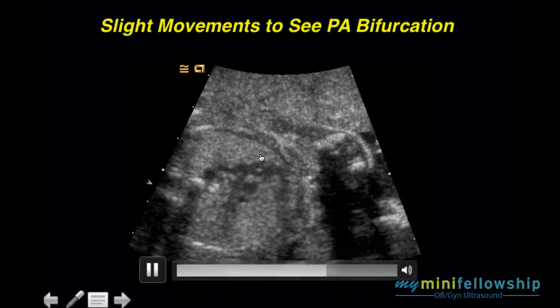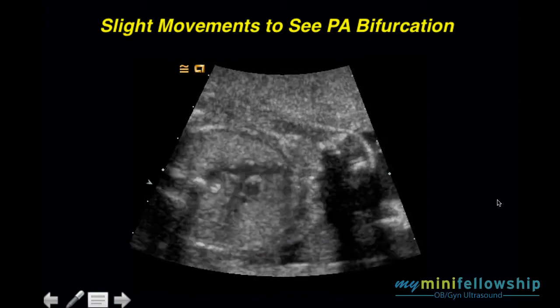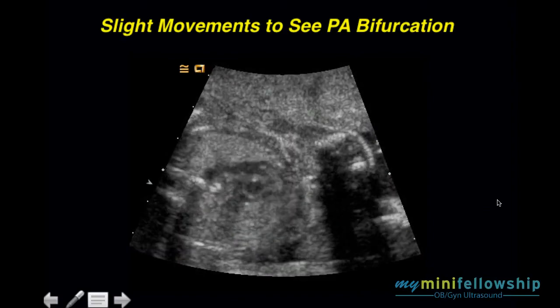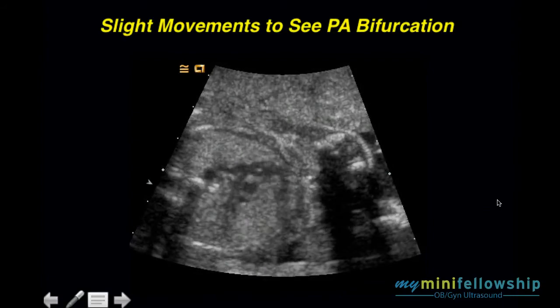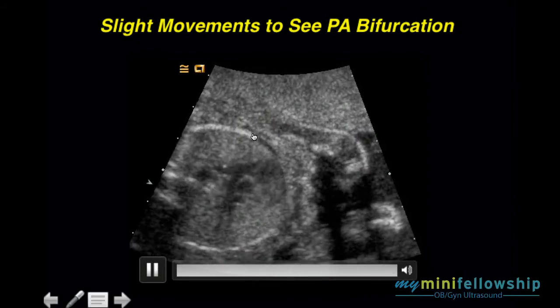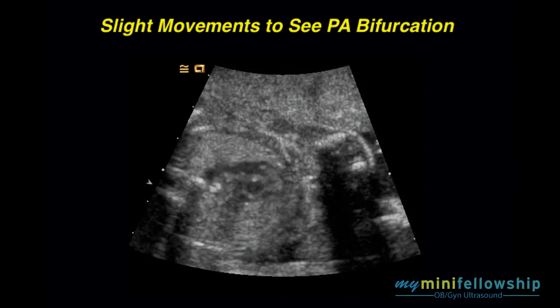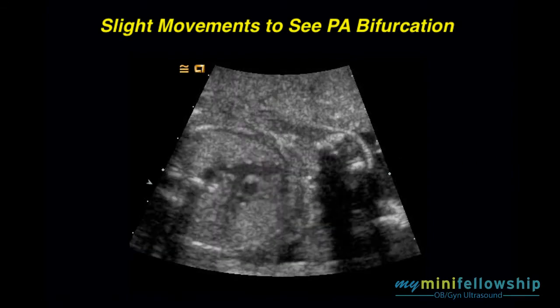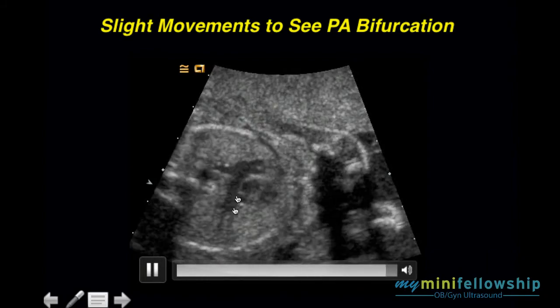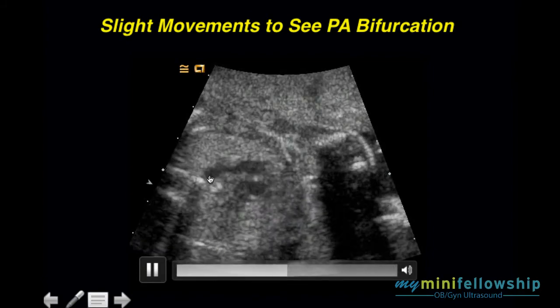What we want to observe is that the branching artery is on the end and more anterior than the aorta. I don't really care which branch I see — right PA, left PA, or the ductus. These three branches lie literally within millimeters of one another. Respiratory movement of the mother can shift the scan plane just two to three millimeters on the fetus, and within that movement you can see the right PA, left PA, and ductus in sequence. So it's entirely reasonable to get a look at all three branches on your three-vessel view.